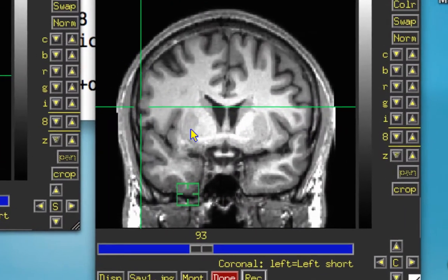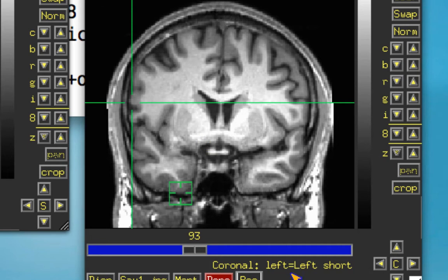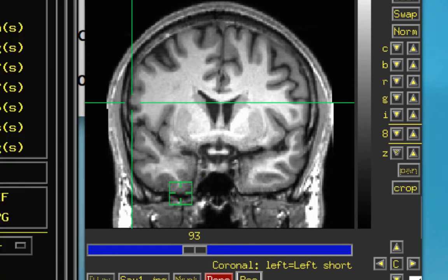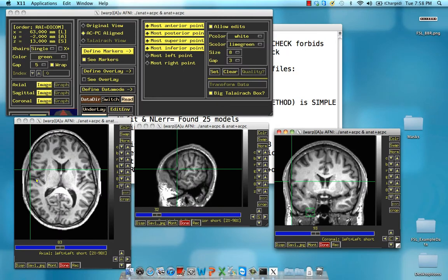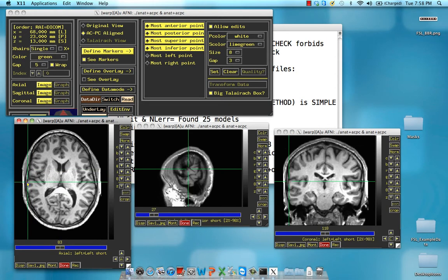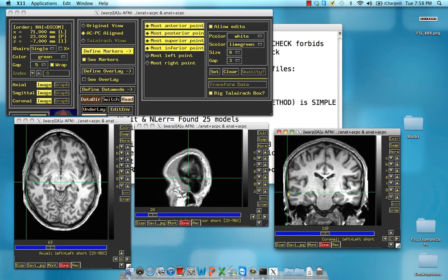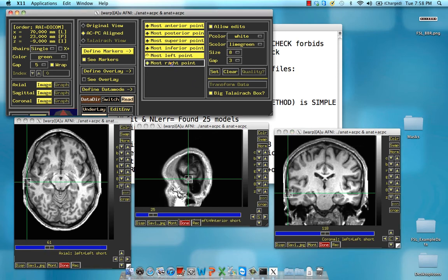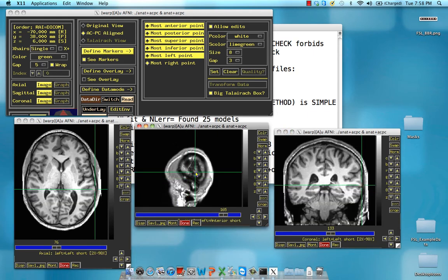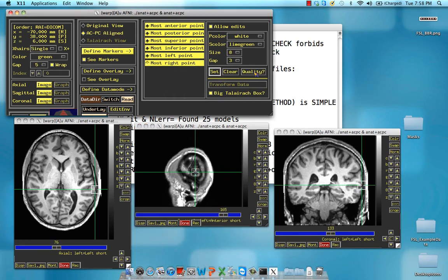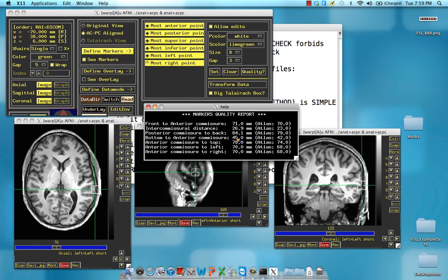For the most left point, make sure you know the orientation of left and right on your images. When AFNI converts data, it stores the left and right header information — you'll see it right here, left equals left in the coronal view. They could be swapped, so verify by looking at the string in the header. Travel along the edge of the left cerebrum using all three views to confirm you're at the most extreme point, about right there. Then set the most right point, similarly, about right here. Click on Quality to make sure there are no errors — if there are none, you're good to go and can transform your data.